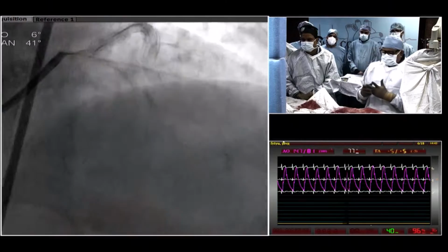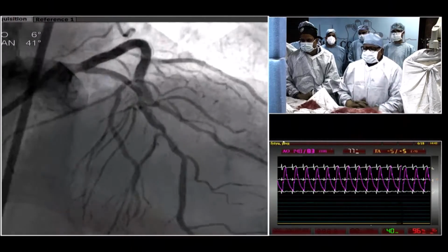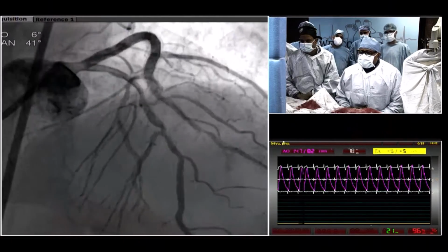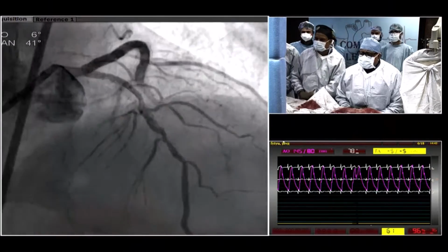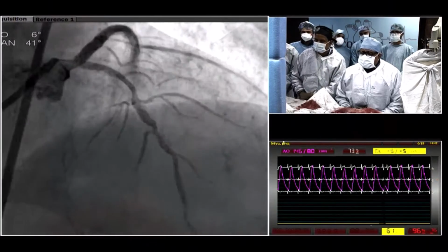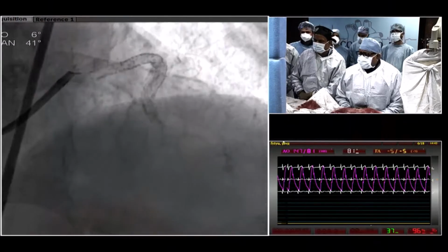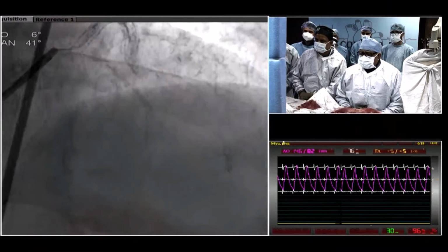That's a strategy I think I would do in this particular patient. So, what is your plan, Rajesh? Very nice. Just quickly spell out your plan in 2 minutes, then we shift to the other lab. So my plan is to go ahead and do the rotablation first to have an adequate plaque modification, followed by the OCT examination to demonstrate how significant the calcium is, and thereafter either using the IVL or cutting balloon followed by stenting.